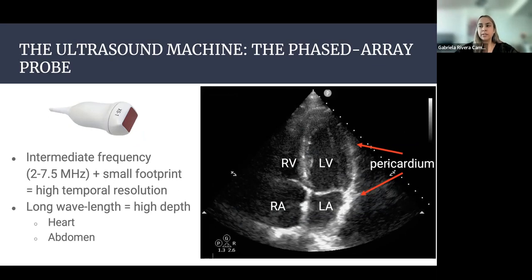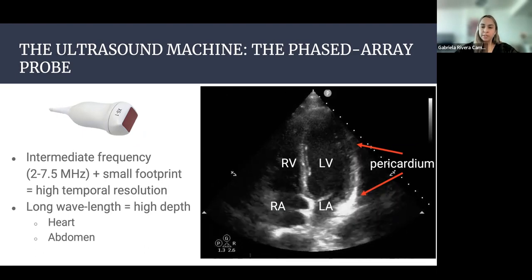However, it also has a small footprint and a high temporal resolution, which is important when looking at structures that move fast, such as the valves inside of the heart. In this image, we can appreciate a great resolution of that mitral valve as it opens and closes.